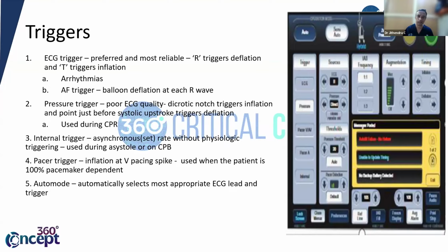So next comes something called the internal trigger. Your ECG is also not working, and your arterial trace is not great.